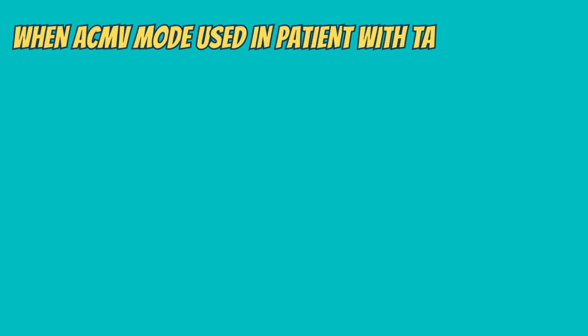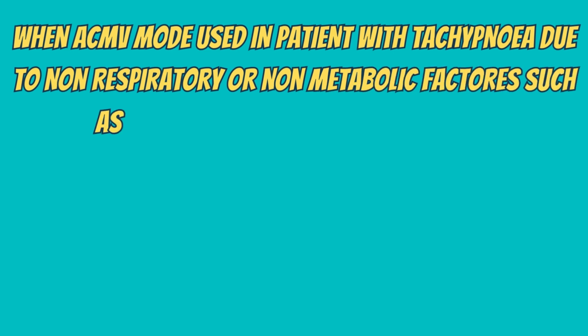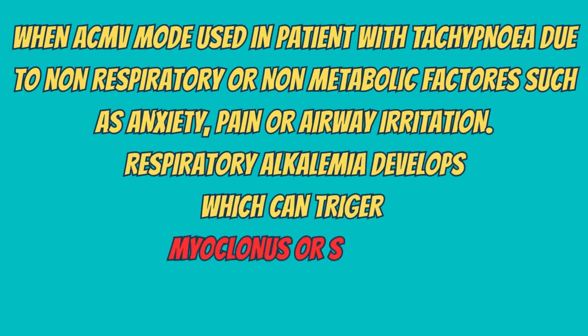When ACMV mode is used in a patient with tachypnea due to non-respiratory or non-metabolic factors, such as anxiety, pain or airway irritation, respiratory alkalemia develops, which can trigger myoclonus or seizures.